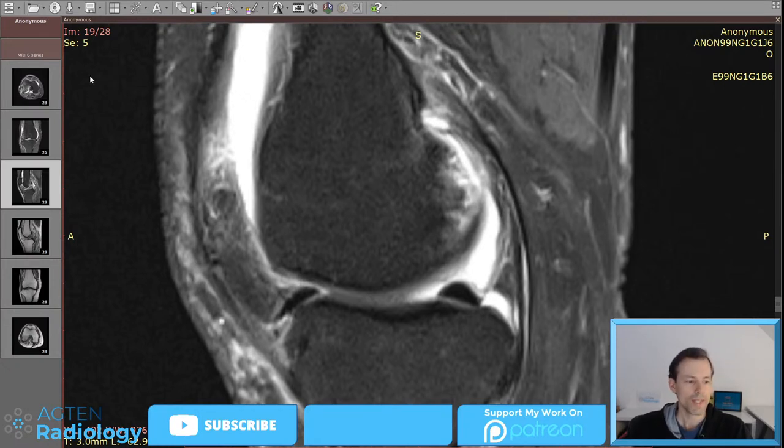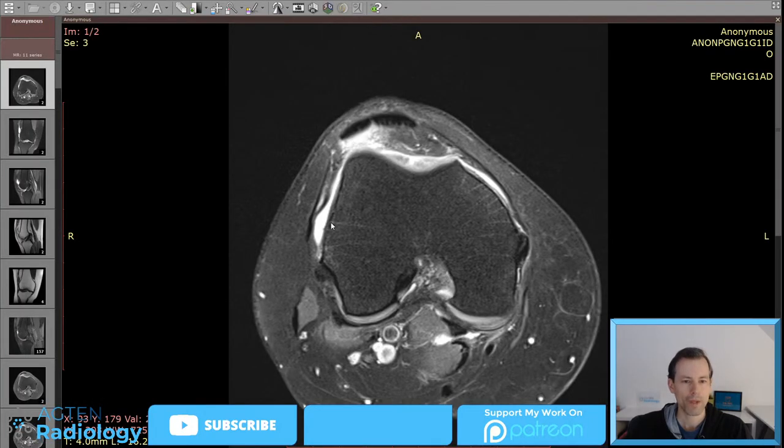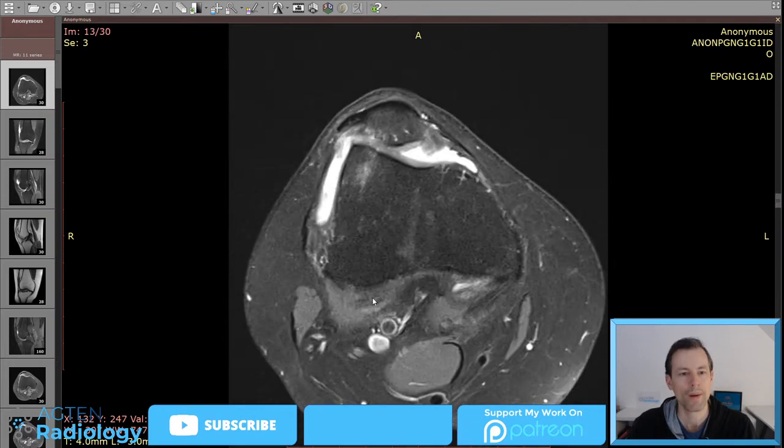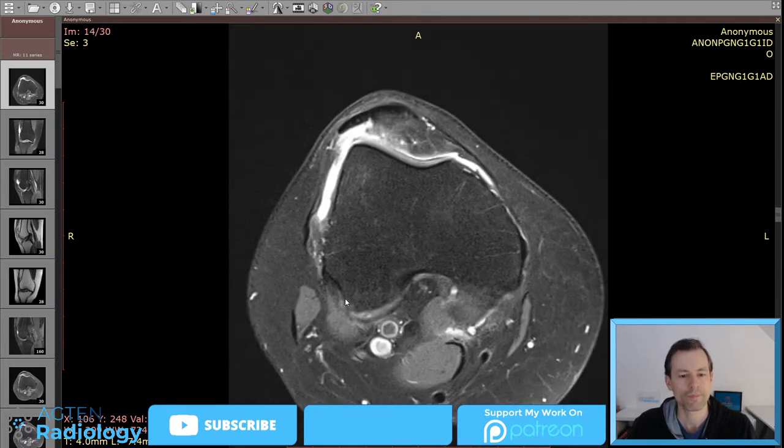So now moving on to the next case, I think it's 20 minutes, that's good. So we have now here a 40-year-old with knee locking. Okay. So it's a 40-year-old with knee locking, and what else was the symptom? So knee locking, and there seems to be a background inflammatory arthritis, but there was no other information given about the kind of arthritis. So that's not so good, because we will see that here just in a second.